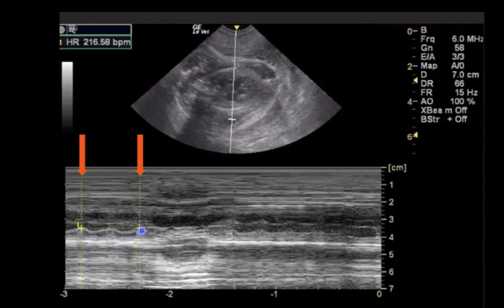As soon as you confirm the position of your second caliper, you will get the fetal heart rate — in this case, 216 beats per minute, which is pretty normal for a feline fetus.